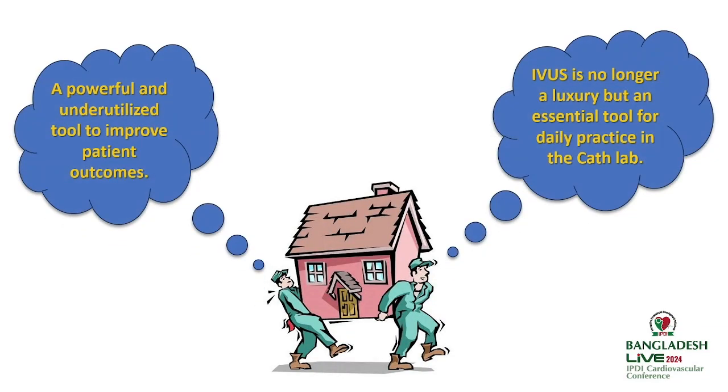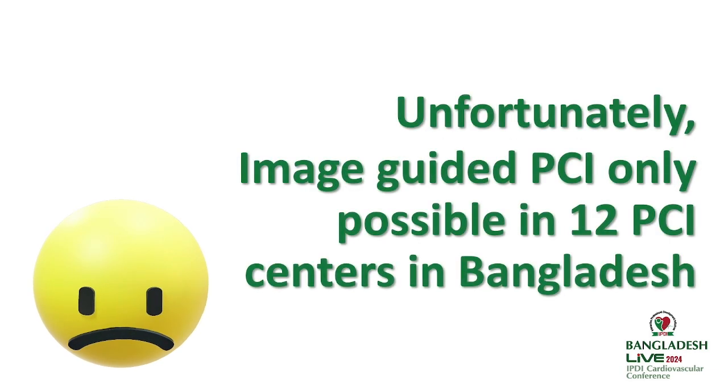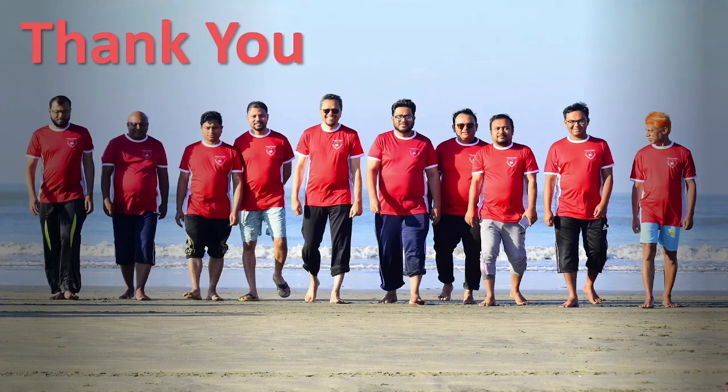Take home message: IVUS is no longer a luxury but an essential tool for daily practice in the cath lab. But unfortunately, image guided PCI is only possible in 12 PCI centers in Bangladesh. Thank you for your patient hearing.